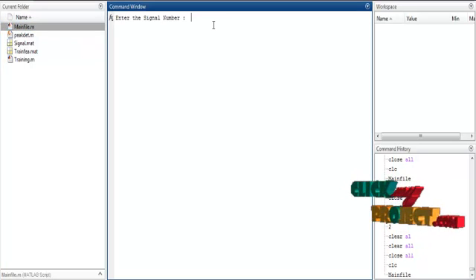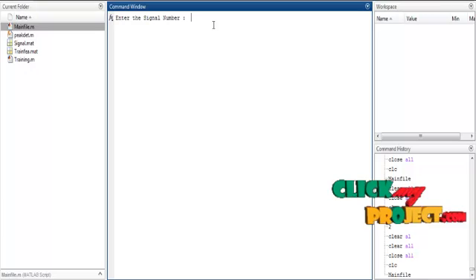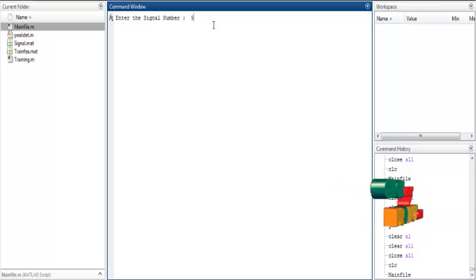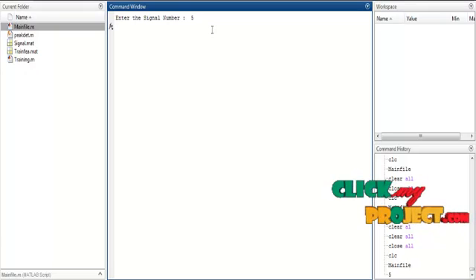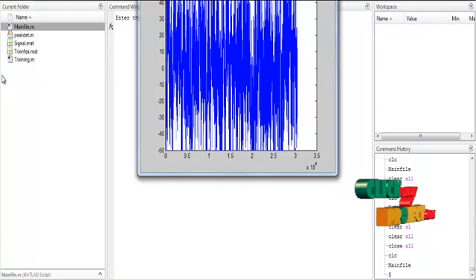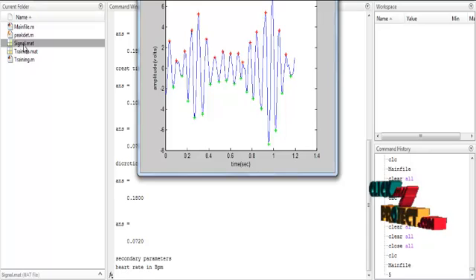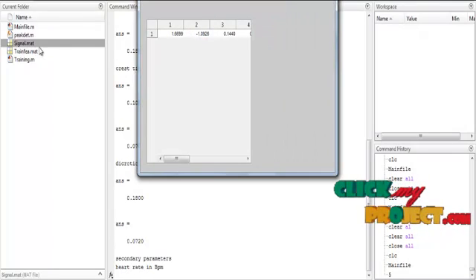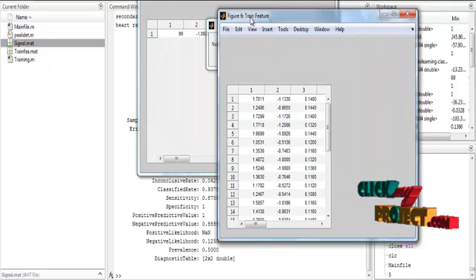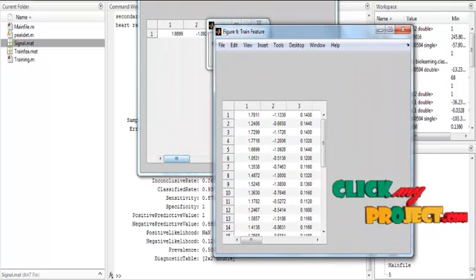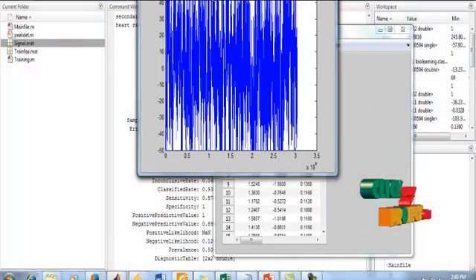Now we have to give the input signal number. I will give the input signal number as 5. The 5th signal is automatically retrieved from the MAT file, which is already stored in signal.mat. Now the process will run automatically. We'll discuss the results one by one.